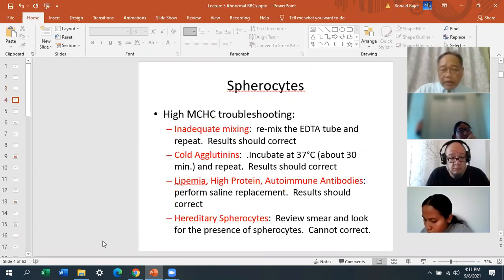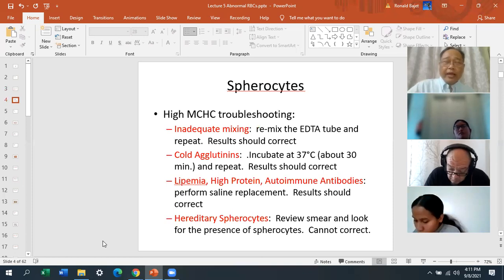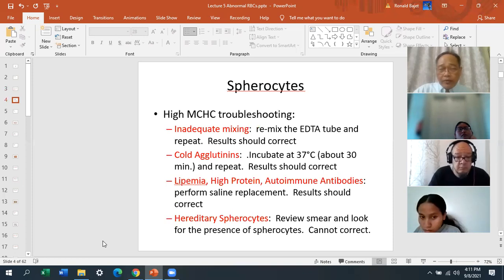Okay, so troubleshooting. I've dedicated a whole lecture, lecture 10, to troubleshooting, but this is kind of an introduction. I told you that the MCHC is one of the first things, if not the very first thing, that you look at when you're reviewing results to determine acceptability. So if you see a high MCHC, then the first step in troubleshooting would be inadequate mixing. If the tube is not mixed adequately, that could result in a high MCHC value. So mix the tube and repeat the results.